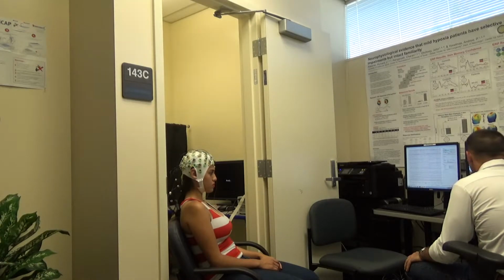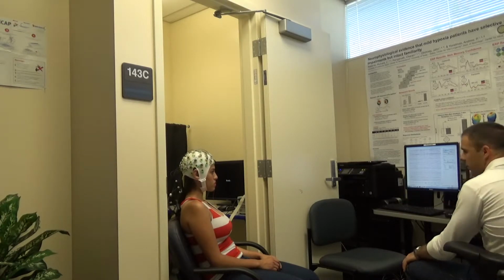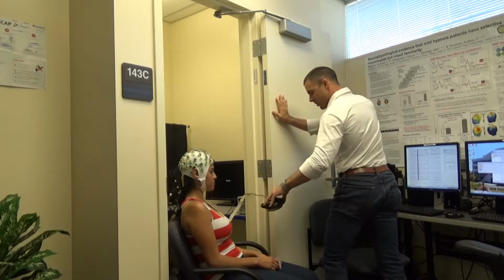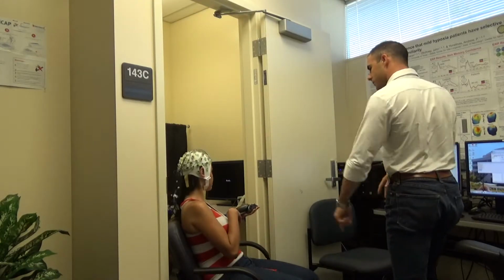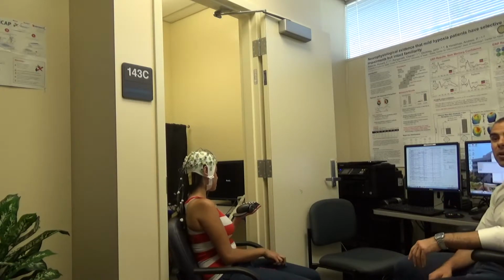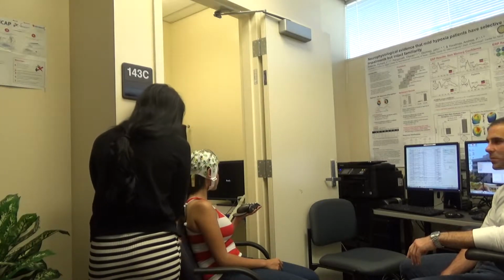Okay, so in the back room we're having the computer screen projected with our experiment. I'm going to reach over here for a second. You can hold back your hand. Now can you see the computer screen? For anybody who can't see the computer screen, what's happening over there is she's running our item confidence and source memory confidence rating experiment.